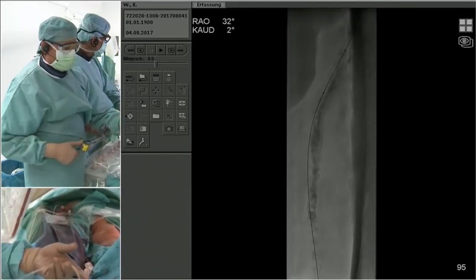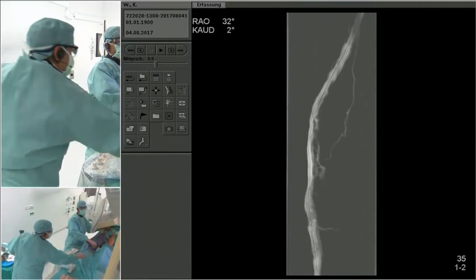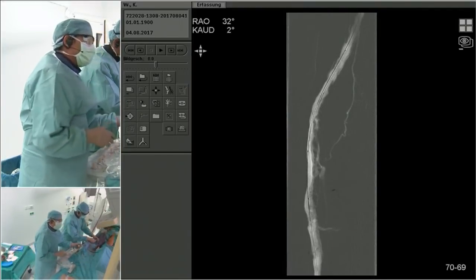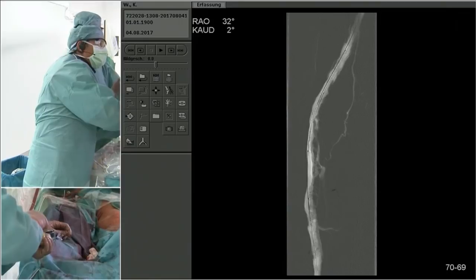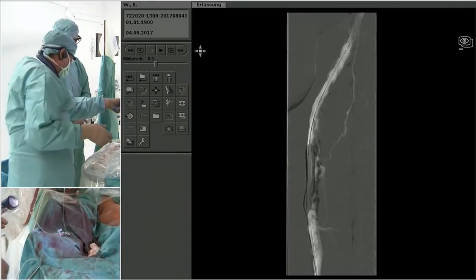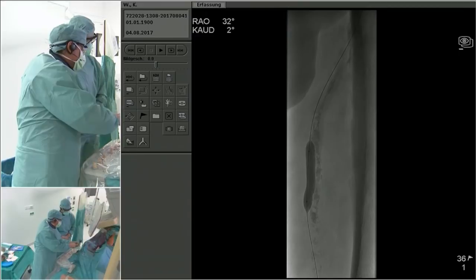That's also my opinion. Therefore, we leave this angulation here, and we do some more aggressive ballooning in this angulation before we start to think of taking a stent in. Yeah, but again, of course, in some patients wounds may heal, and you may leave it like this. But in the claudicant, I think restenosis is for sure, and therefore I think he needs a better treatment. So I really worry about covering those branches with a covered stent because it's a very diseased artery, so it can block anytime.